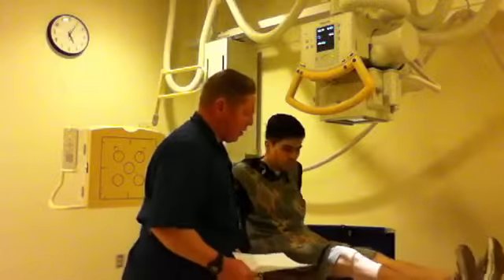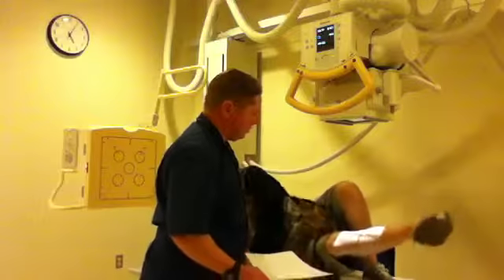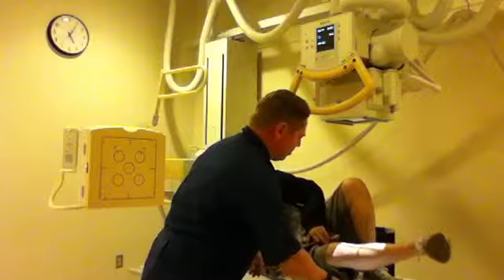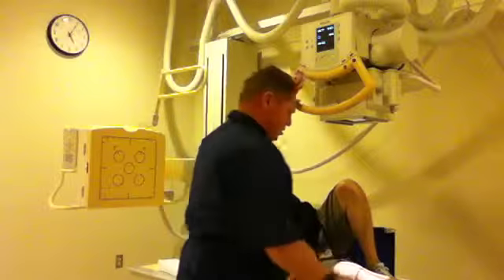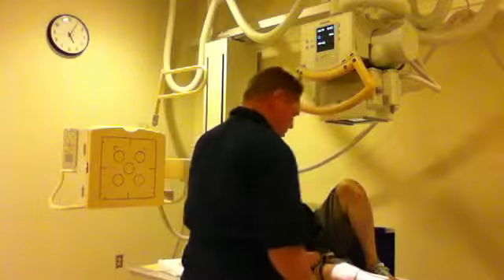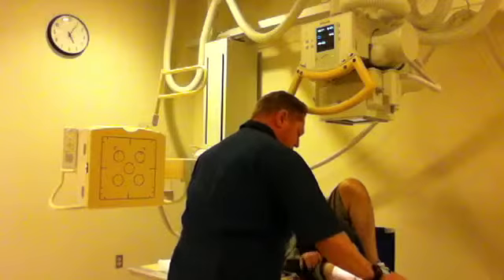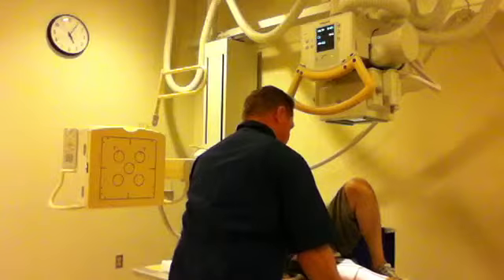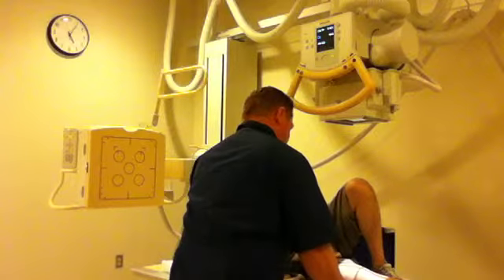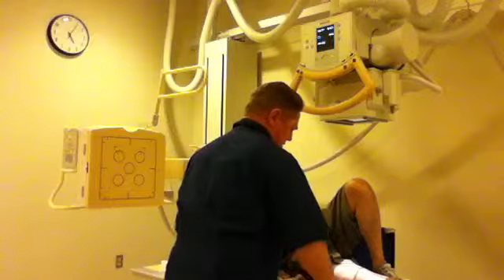And then now I'm going to go for the lateral. So if I can have you turn on that side. Making sure that the foot is down. You want to make sure that the condyles are overlapping on top of each other, superimposed. Center right in the middle of the knee.